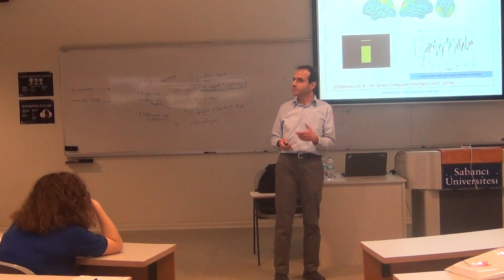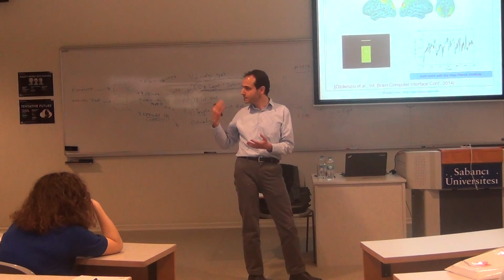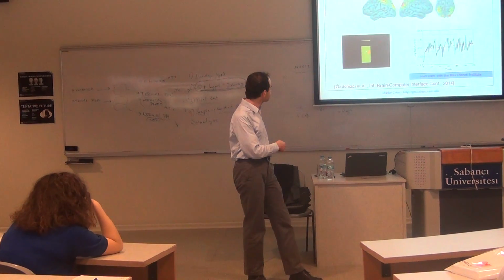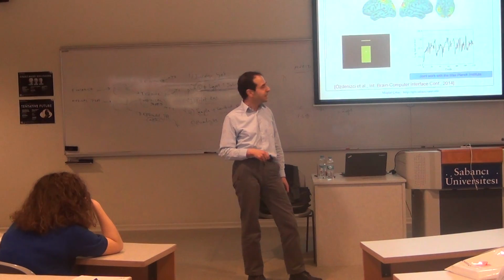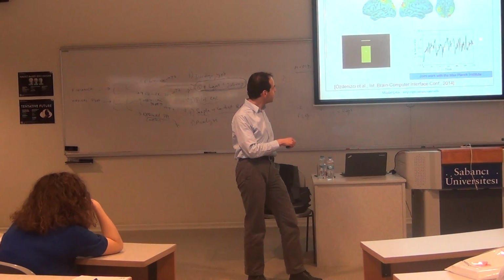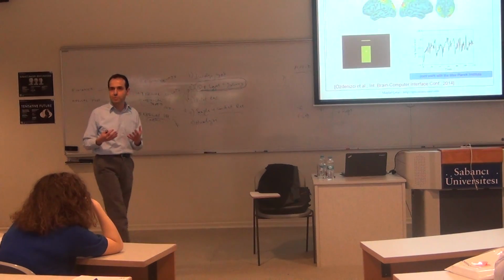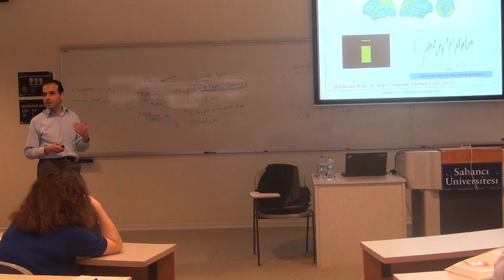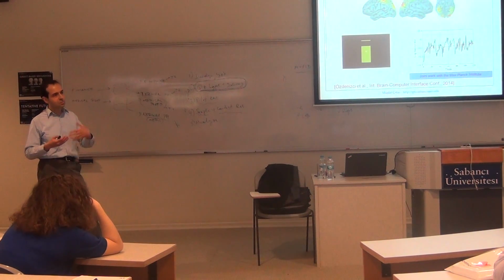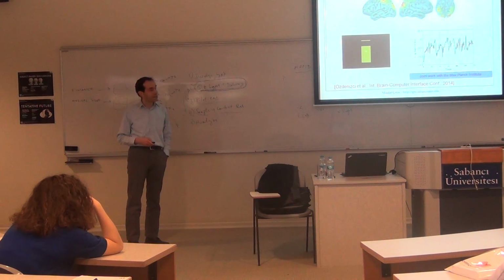And then you can come up with games in which you reward the subject for increasing that type of activity which has been lost. So you can come up with a game in which that activity is modulated. And then you can monitor how well that is improving. So hopefully at the end of this, you will help the person recover that type of brain activity that has been lost, and hopefully that will be related to better motor recovery of the patient.